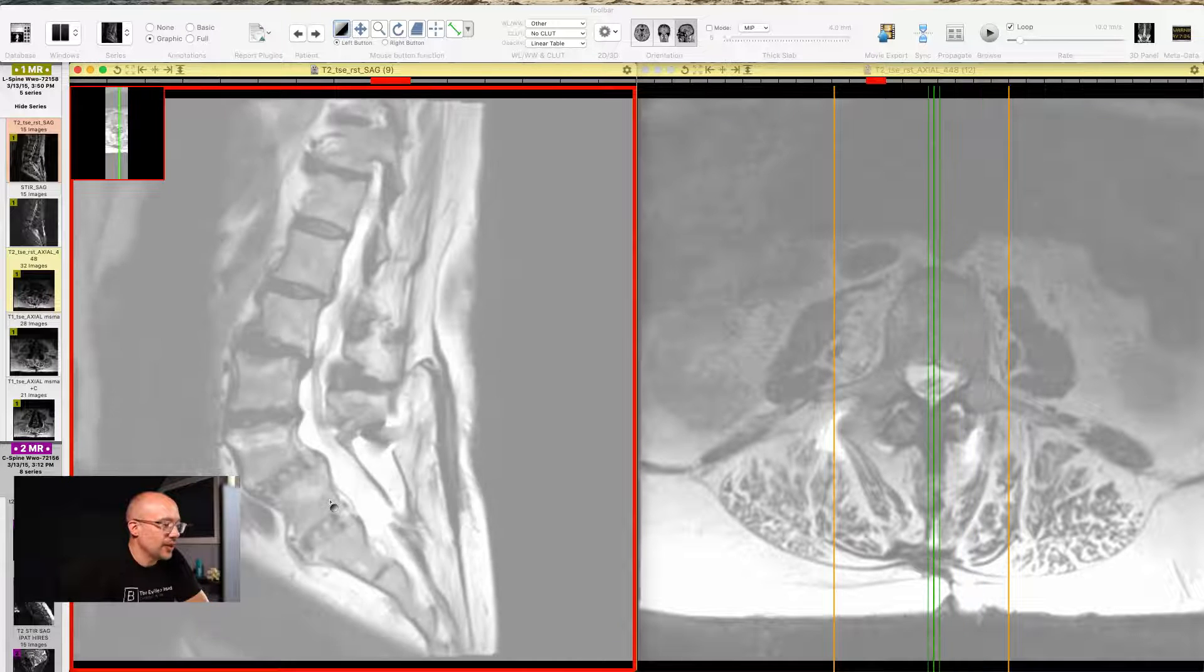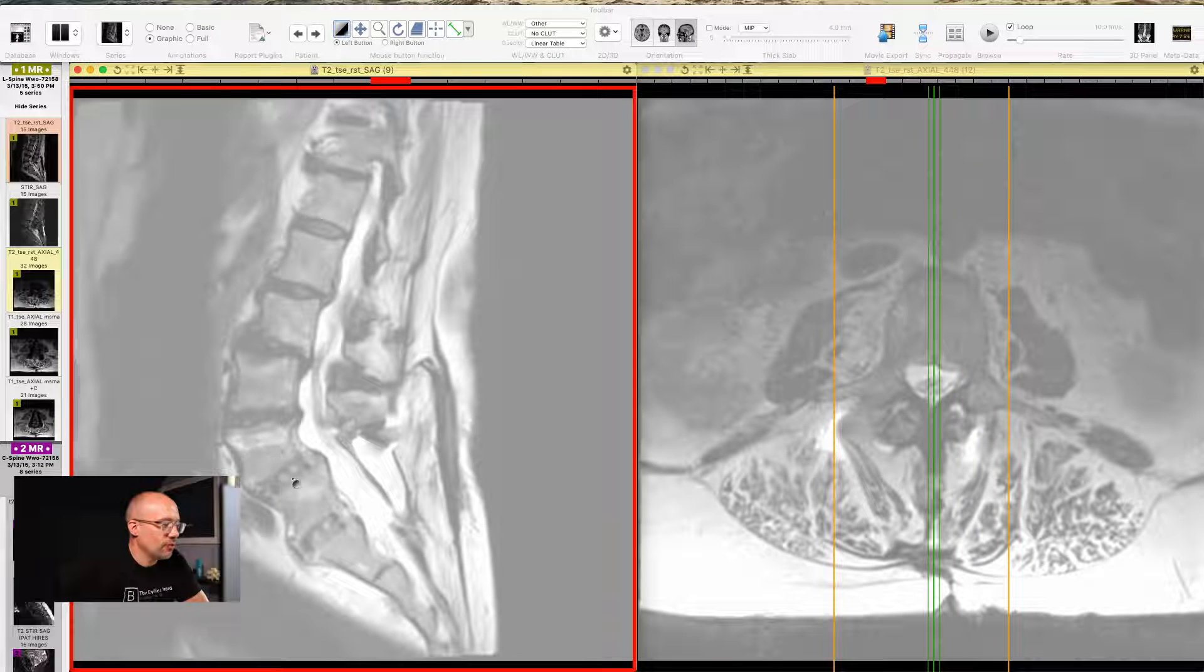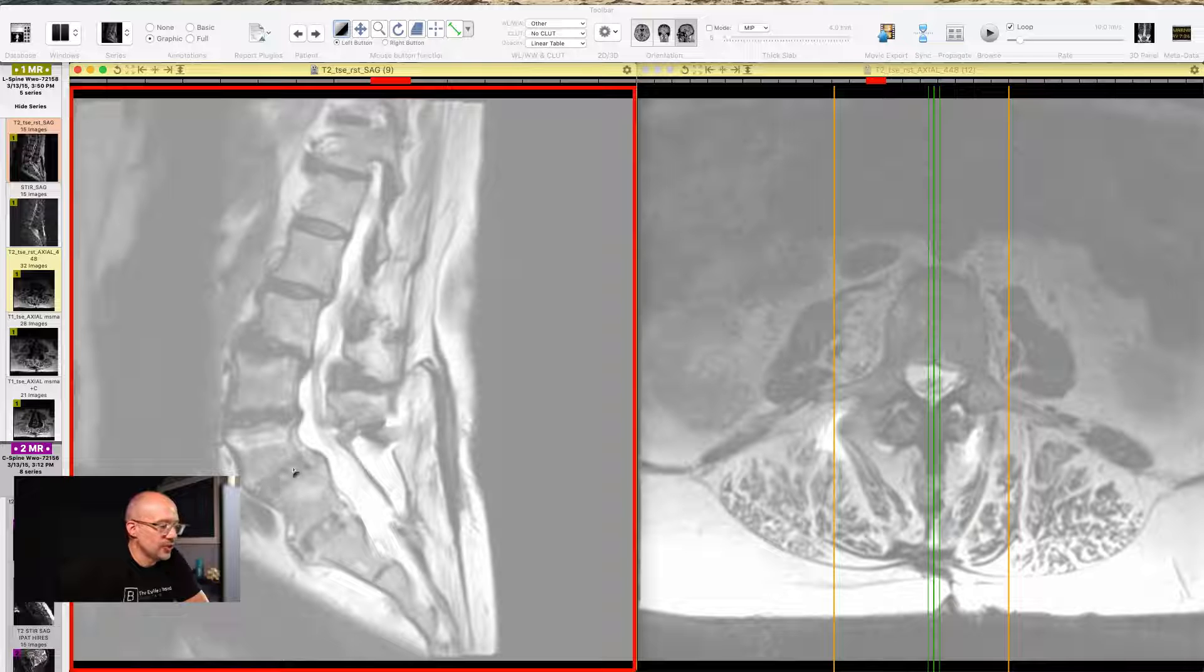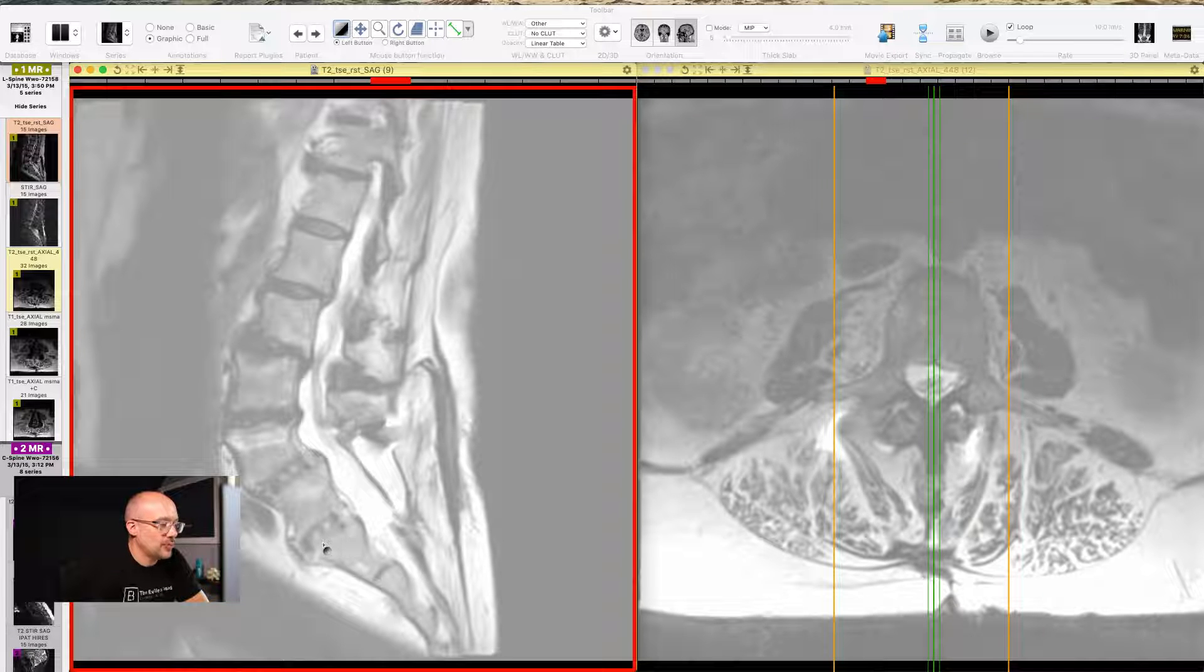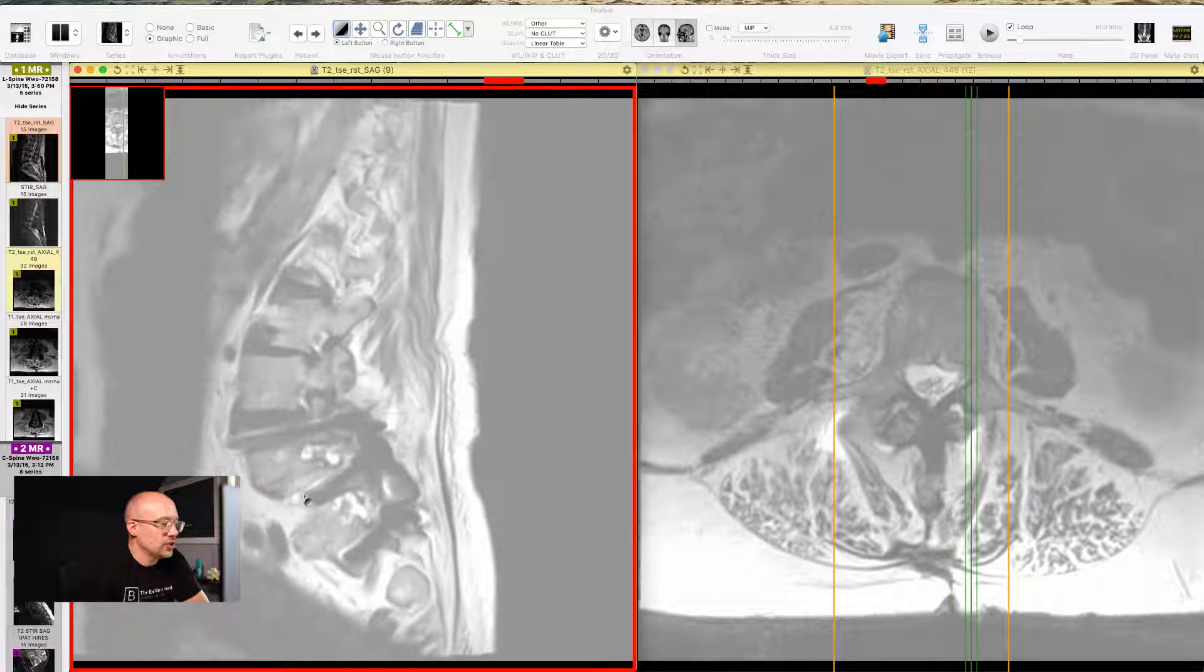So that is why between L4-L5, that disc space right there, and between L5-S1, that disc space right there, that's why it looks so different.